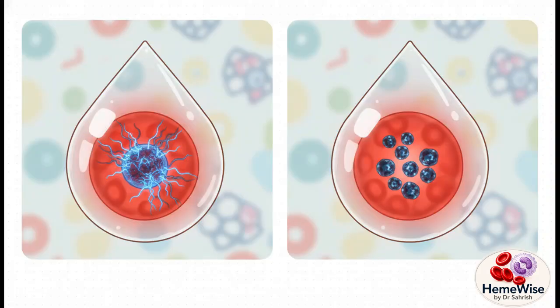To avoid misinterpretation here, and to make sure we aren't artificially inflating our reticulocyte count, we really have to correlate the morphology with specific stains. For instance, true reticulocytes will enthusiastically stain blue for RNA with Azure B or new methylene blue. But if you're looking at a slide and suspect those coarse dots are actually Pappenheimer bodies, you absolutely must use a Prussian blue stain to confidently identify that iron content. It's all about matching your visual cues to the actual biochemical reality on the slide.